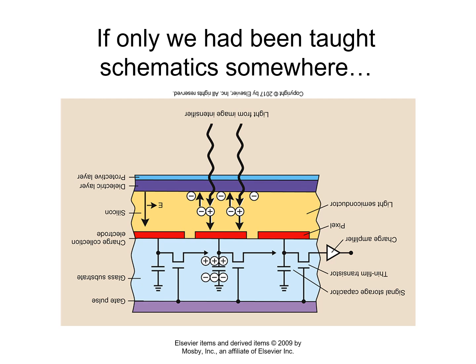So very much like water moving through the bucket brigade, the positive charges move row by row sequentially from the second row of pixels down to the first row of pixels, and then off onto the amplifier. Okay? And that's the better explanation for how a CCD works.